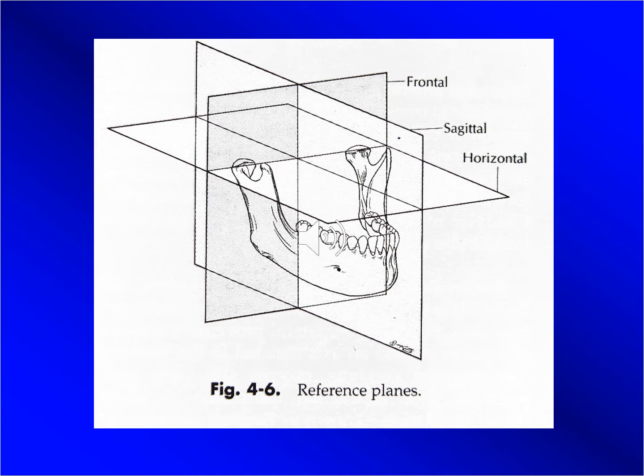And as I said before, all that reproduction of mandibular movement is needed to be able to create an occlusion that is in harmony with the opposing dental arch in these different positions and to reduce the need for intraoral adjustment. And the more complicated the procedure is, and the more rigid or fixed it is, the more there's a need for such accurate reproduction of mandibular movement and reduction of the need for intraoral adjustment, which will be more troublesome or even impossible.